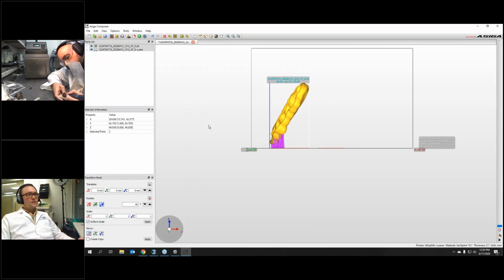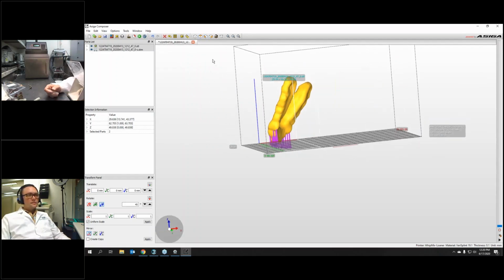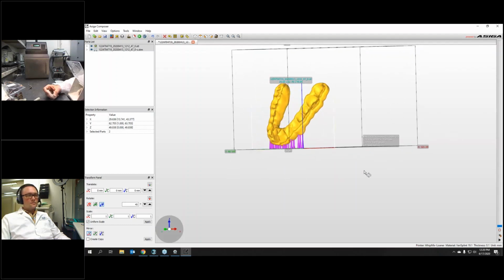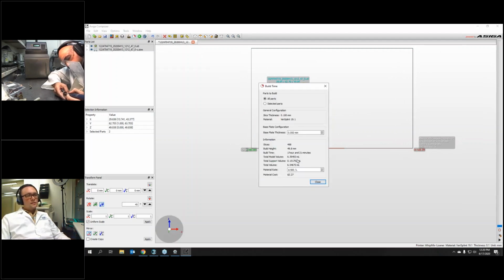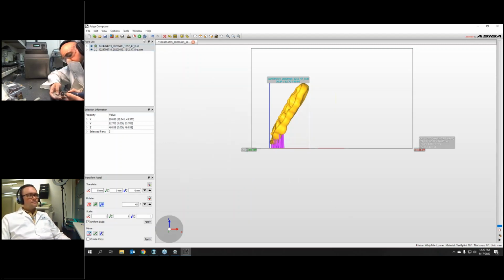And you may need to, depending on the orientation, adjust that internal offset of 100 microns. But you can see there, we pretty much don't have any supports on our occlusal surface. And just as an idea of the difference in time, you'd be looking at about an hour and a half for this print. So about half the time. I think the 20-degree one we did in the other webinar came out around 45 minutes. 38. 38, okay.